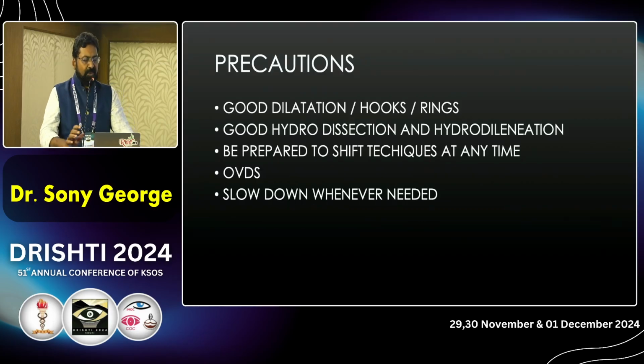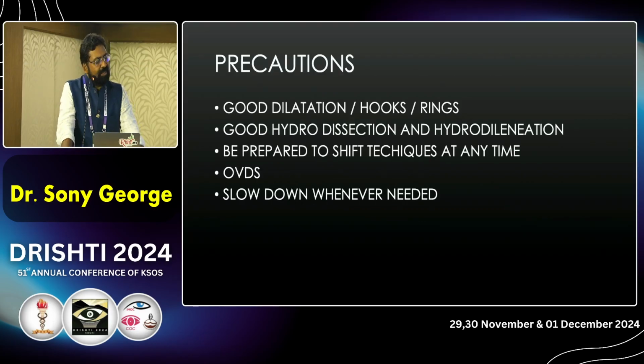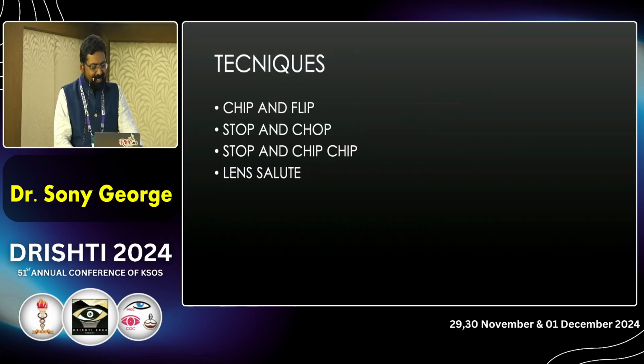We have to make sure we are ready, like there should be good dilatation. You should be ready with hooks and rings if necessary. A good hydrodissection and hydrodelineation is very imperative when dealing with these cases. And like I said, be prepared to shift techniques and slow down whenever needed. And generally we think OVDs are necessary only in hard cataracts, but here they are necessary too, the viscoelastic devices.